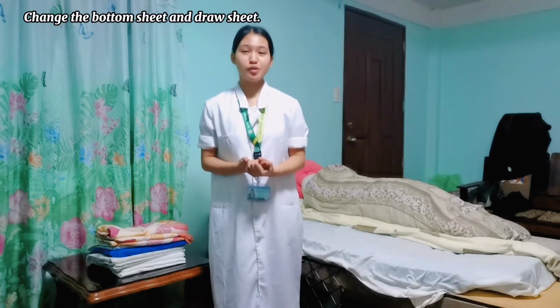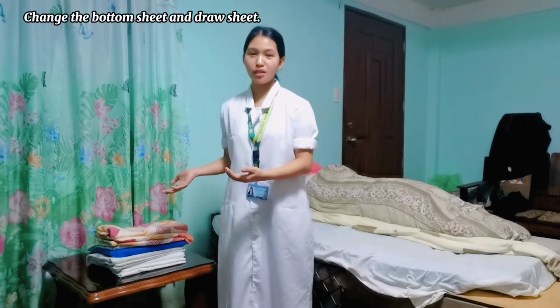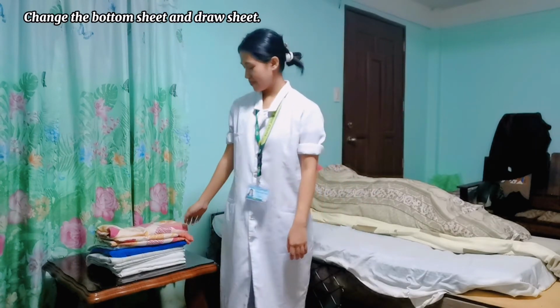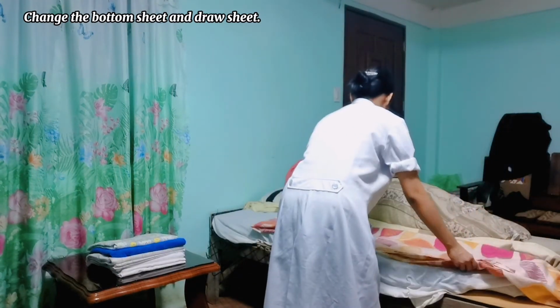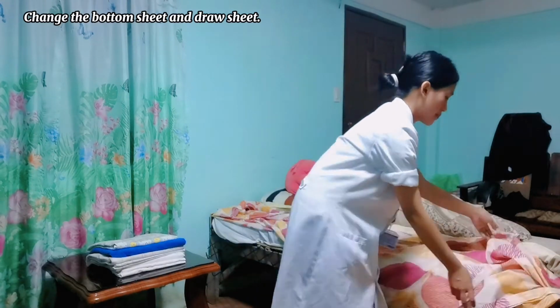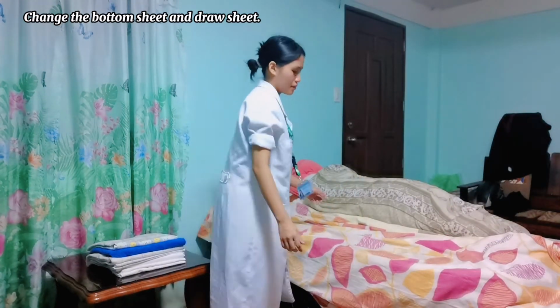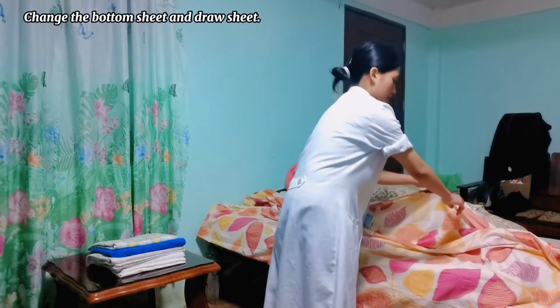So the next thing we are going to do is put the clean bottom sheet on this side. Make sure to fan fold this edge.